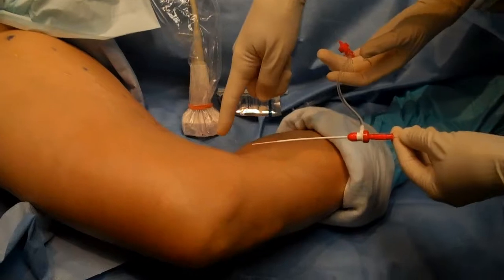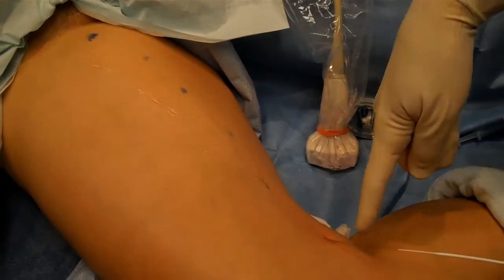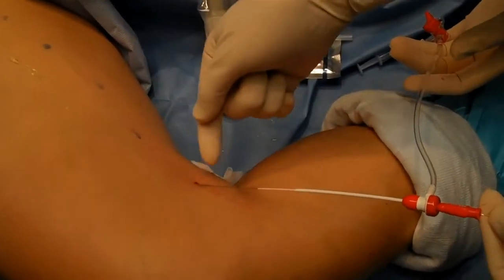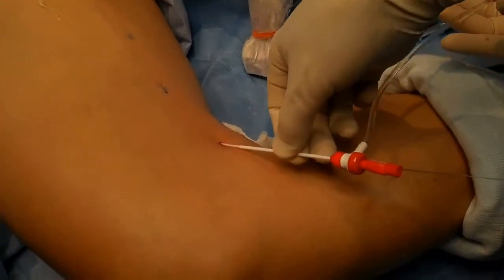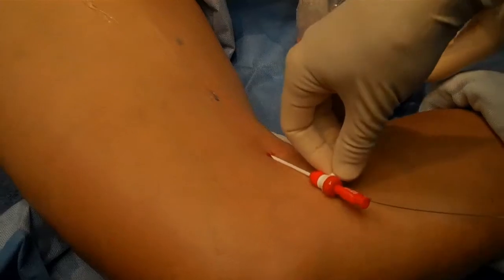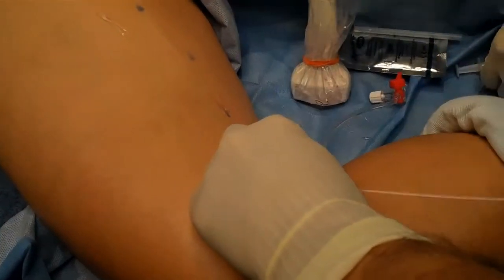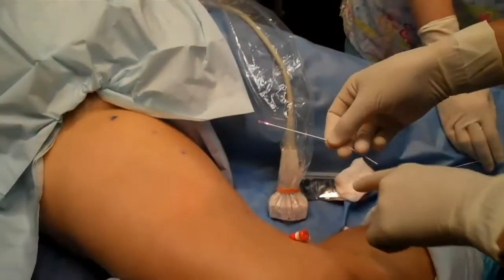We are going to treat with endovenous laser ablation your greater saphenous vein, the upper part above your knee. I've passed the wire in the vein — the tip of this flexible thin wire is there. We're passing a tube over that into the vein, so we have a nice access now. We don't need the wire anymore, so there is a little tube now sitting in your long saphenous vein.